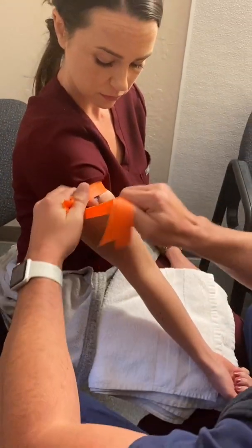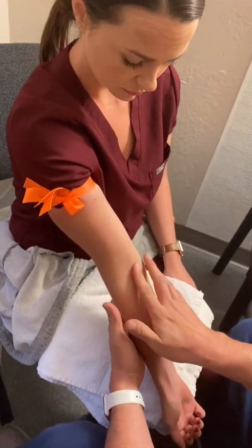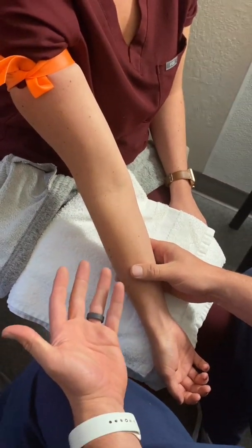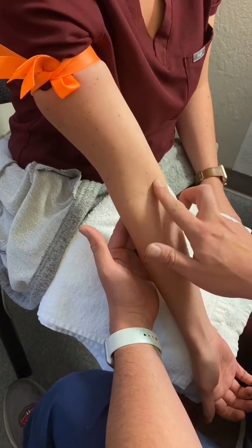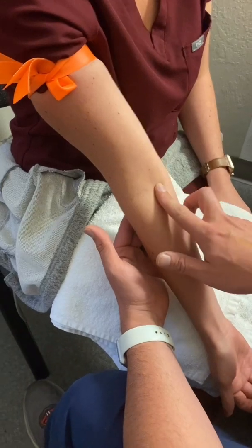All right. So for this purpose here, I'll put on the tourniquet and I will search for the vein that feels the best for me. How do you know it's a vein? It's determined by the rebound. Now, of course, some veins you can see, but if you can't see it, you feel for the rebound. Veins have good bounce, good rebound. Tendons don't have that. And how do you know it's a vein compared to an artery? An artery will have a pulse.